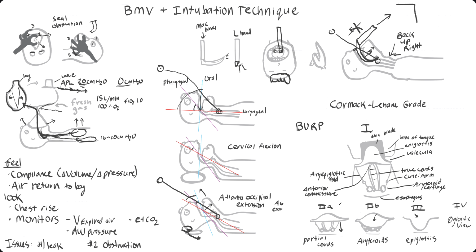The reason you're doing that is because technically you're kind of looking on the right-hand side because of the way the Mac blade is designed. So by moving your whole glottis to the right, maybe that will facilitate your view and the pressure.